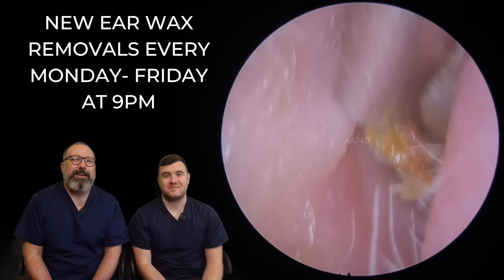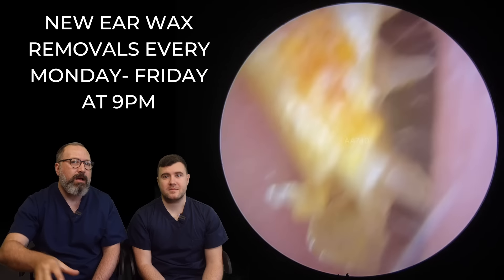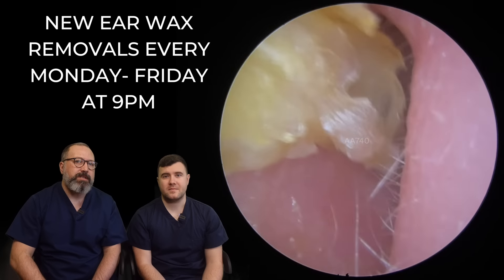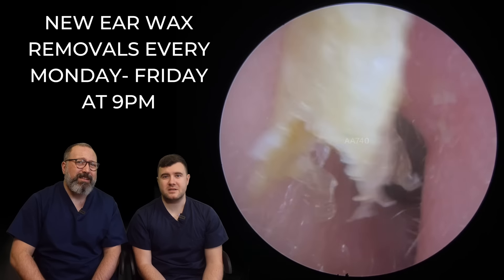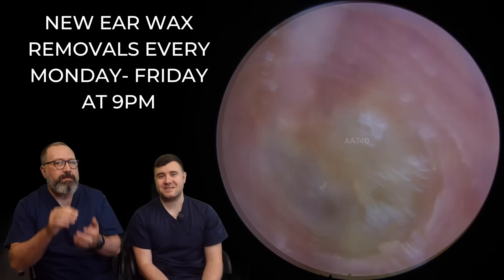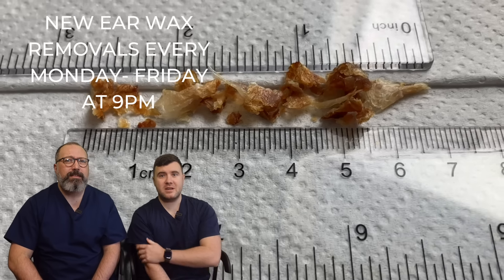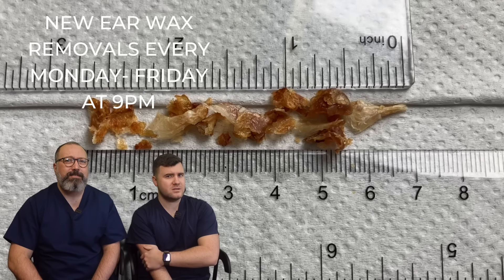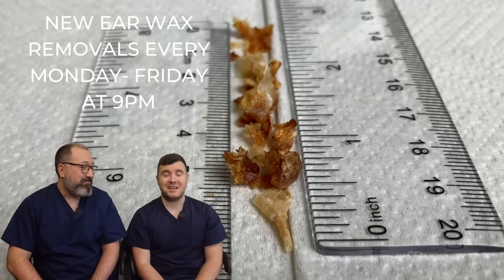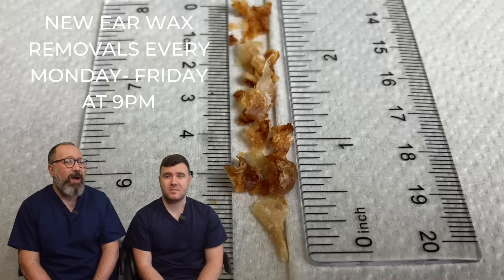So it's coming away really, really well. We've got this deeper section here — this is the fresher skin. We know we're getting to those last couple of layers now because of the changing consistency of the skin. But look at that coming away — that is a nice piece of skin. And there's the eardrum. It came away perfectly, really well. Sometimes you can leave these little lifts in there, but that's a real difficult one to remove. Two and three quarters inches — wow, two and three quarters inches! That's seven centimetres worth of skin in there, guys. I mean, there was very little wax mixed in with that; it was just purely, purely skin. It's quite surprising for three months — there's a lot, isn't it? Look at how much has built up in that amount of time.